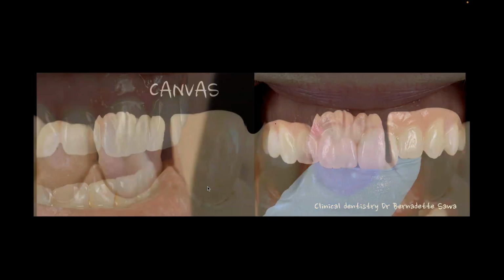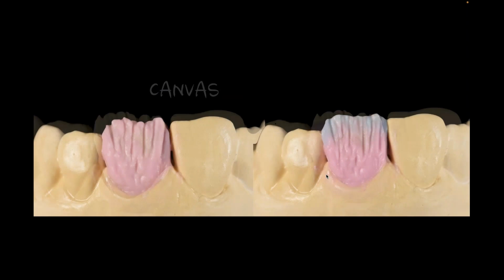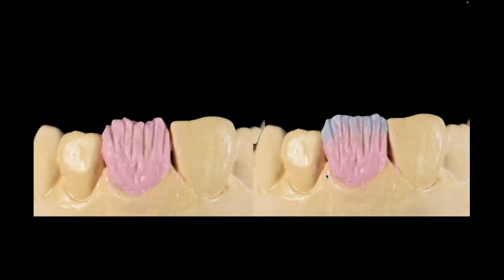But that's the idea. What is the consistent part is the canvas. I'm creating the canvas the same way, and my canvas is either some opacious dentin material or the coping itself is providing that for me. I build my dentin. From my dentin, I start to transition into translucency. Notice where the translucency on this case is. It's almost halfway through the tooth on that distal corner. I probably even could have come down a little bit more on the mesial corner, right?